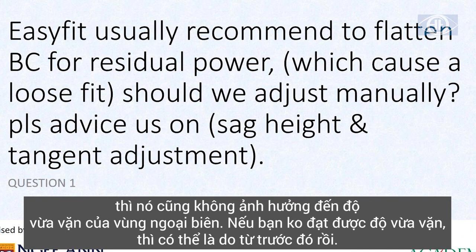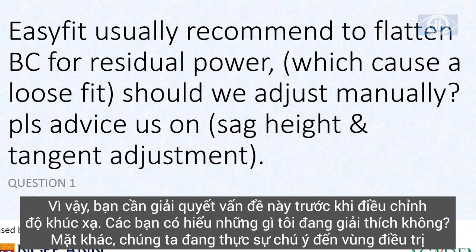If you end up with a loose fit, probably you had a loose fit beforehand. You had to solve it first before you adjust the power. Make sense what I try to explain? It's the other way around. We are really focused first on the treatment zone and then on the tangential zone.